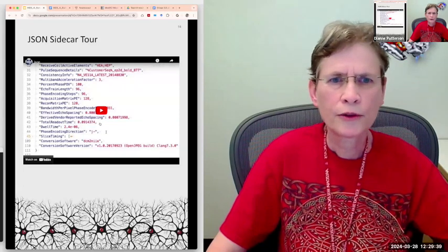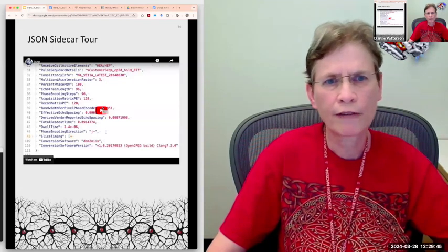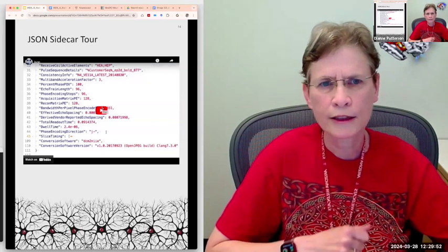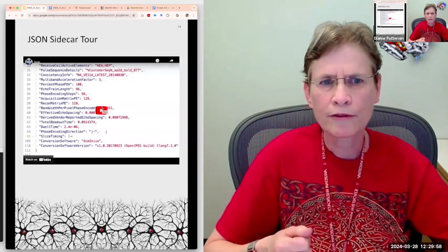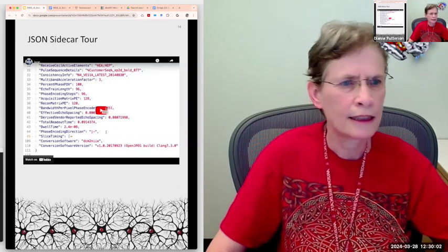So I'm going to take you through what one of these JSON sidecars looks like. This is a BIDS JSON file for an fMRI sequence. At the very least, the JSON file contains information you want for your methods section, like dwell time. But BIDS apps can also read these values, and importantly, much of the information in the DICOMs that doesn't make it into the nifti is here.